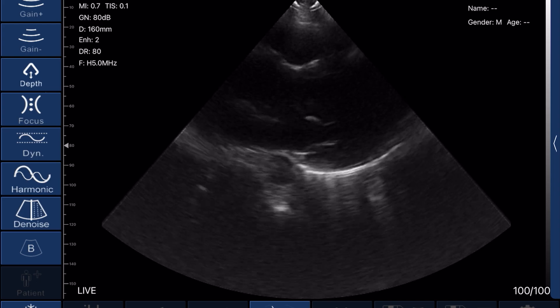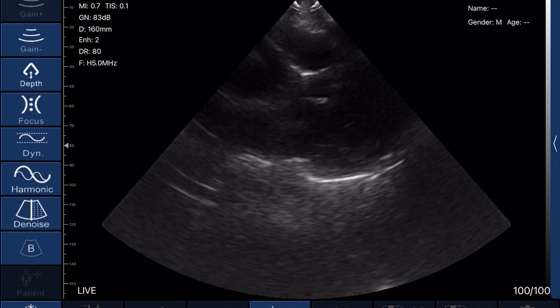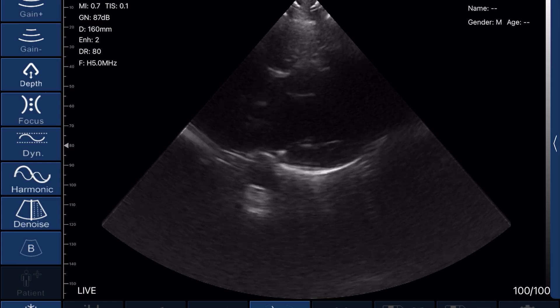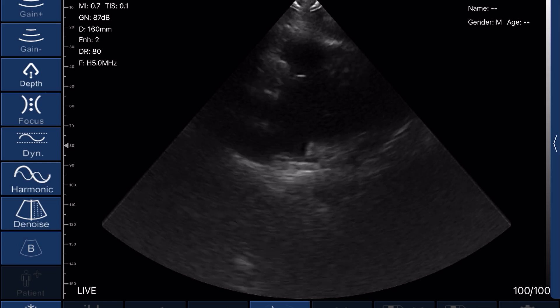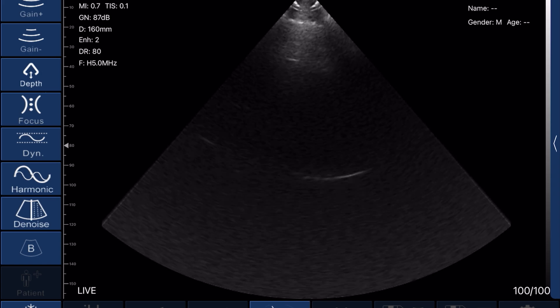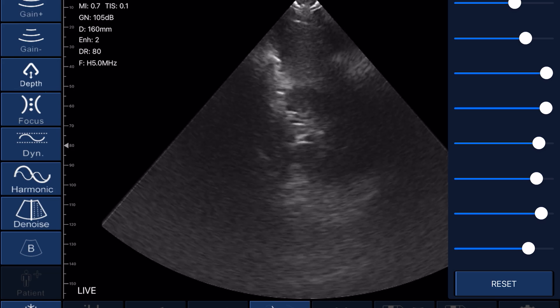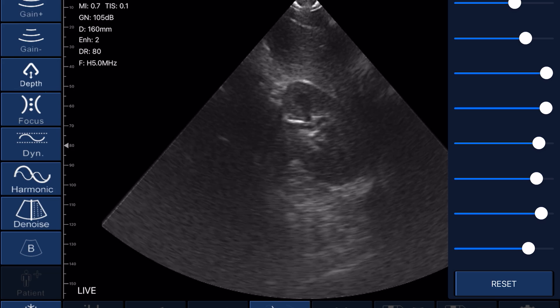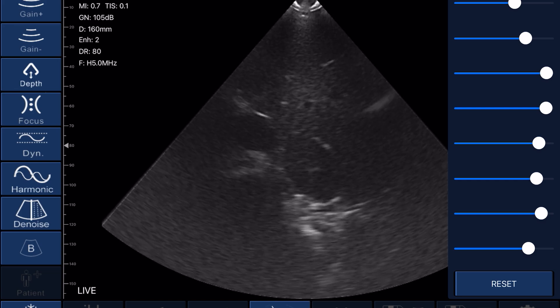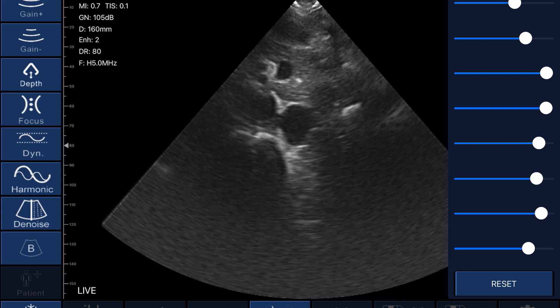Here are some examples of using the Tri-Scan Max on myself. Here's a parasternal long view of my heart. I have the probe backwards and the technique isn't the best, but if I increase the gain, you can see my mitral valve, left atrium, and left ventricle. Next, heading down to the abdomen, you can see my right kidney, my liver, my descending aorta, and the IVC.